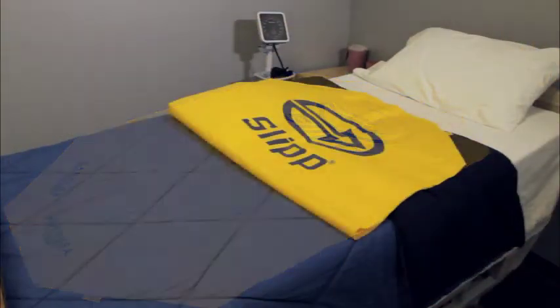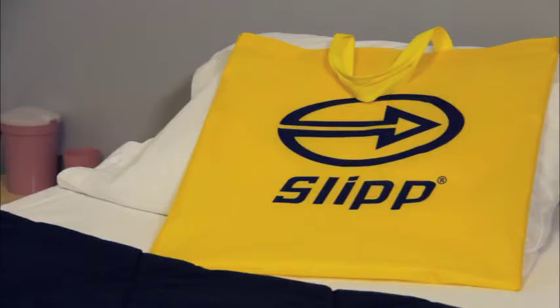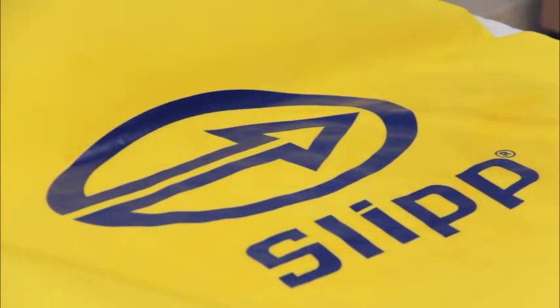Folded, Slip takes up less space than a pillow and weighs less than three pounds. Each Slip comes complete with a tote bag, instructional DVD, and illustrated written instructions, and has a one-year warranty against defects in materials and workmanship.